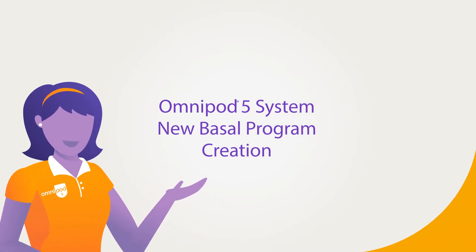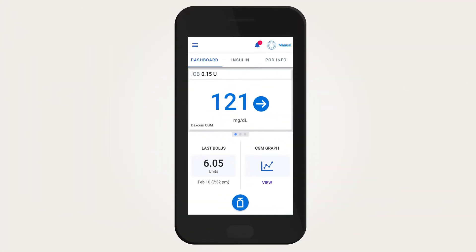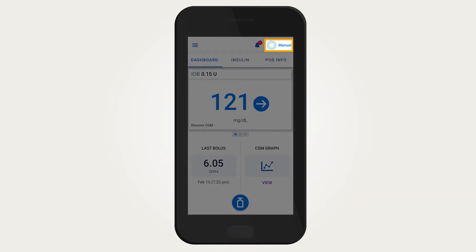Omnipod 5 system: new basal program creation. Creating new basal programs will only impact manual mode insulin delivery. Having more than one basal program can be helpful when insulin needs vary when using manual mode — for example, weekdays versus weekends.